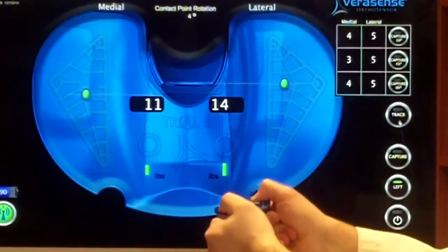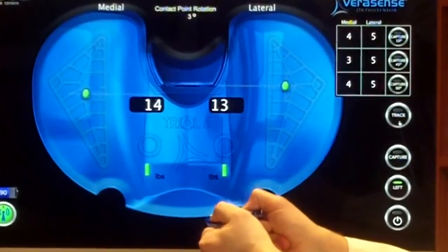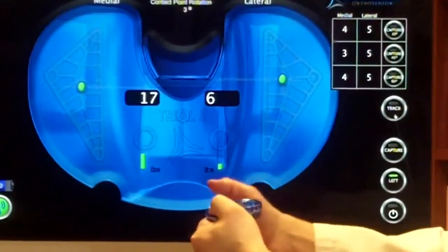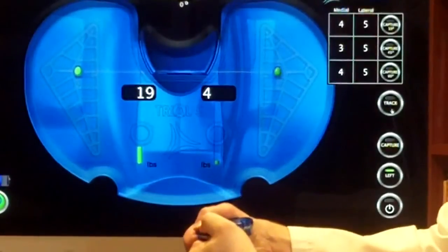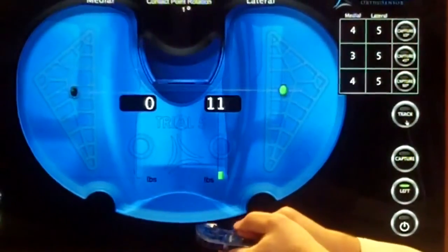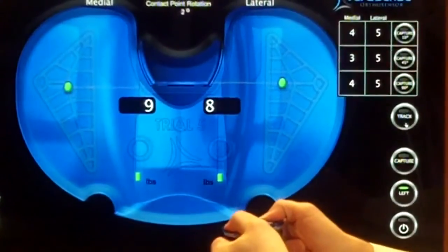So if we had a result such as this, when the insert is put in, that would be actually a good balance here. You want to avoid something that looks like this. This is considered too tight medially and not tight enough laterally. And same thing vice versa here. You like to see a bit of symmetry with this.